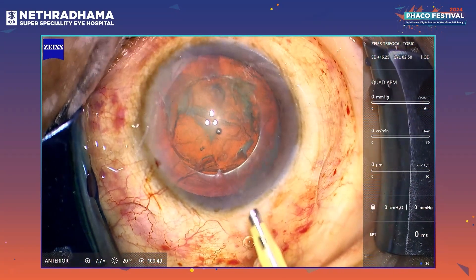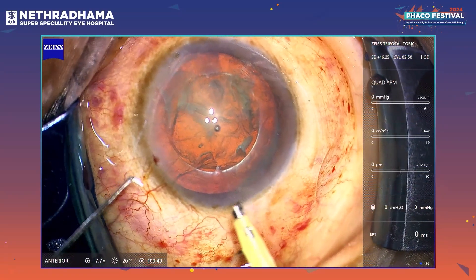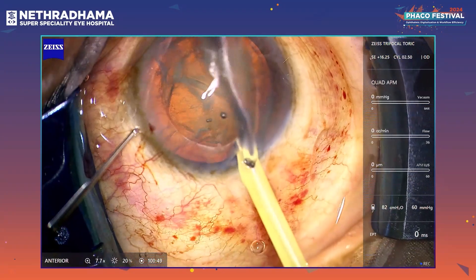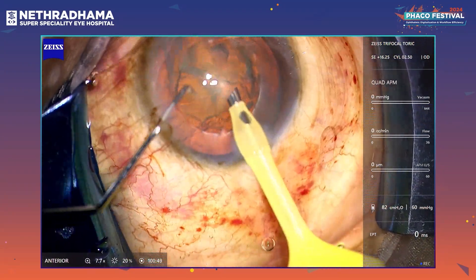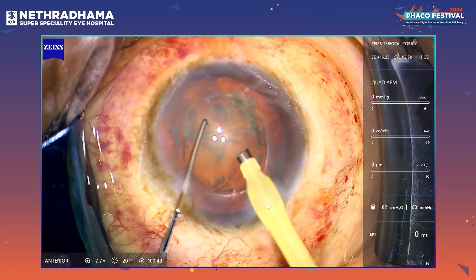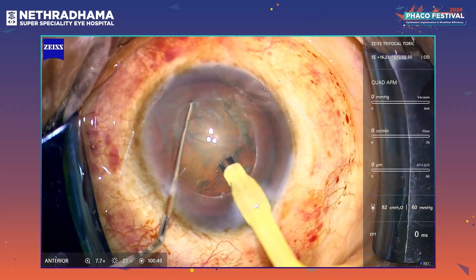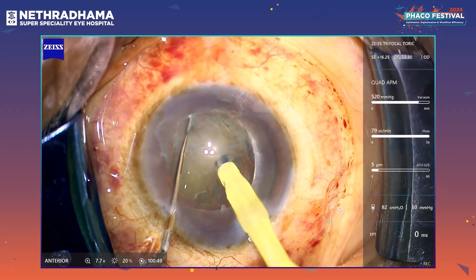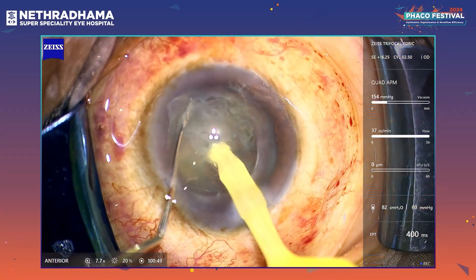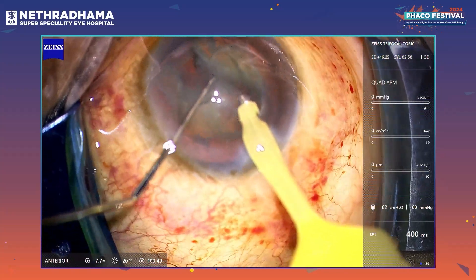This is the Quatera 700. My settings are 650 vacuum and I am using a vacuum-controlled mode. The flow rate is about 90. I am doing a direct chop technique here — we have to angulate the tip quite a bit; it is a straight tip. That's the first chop through and through.